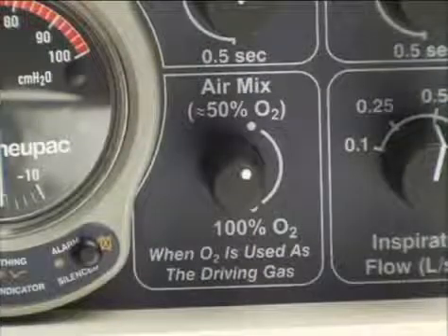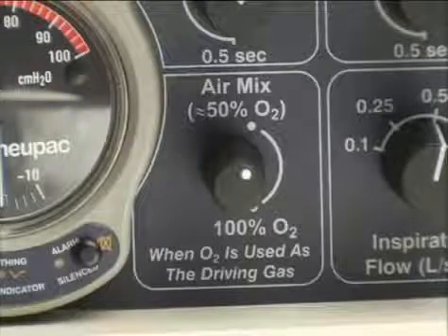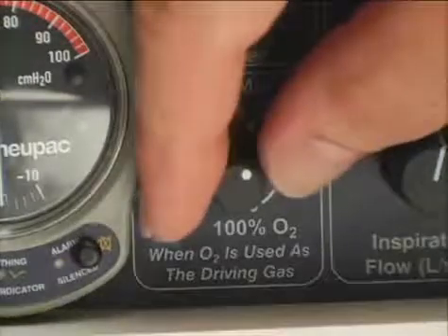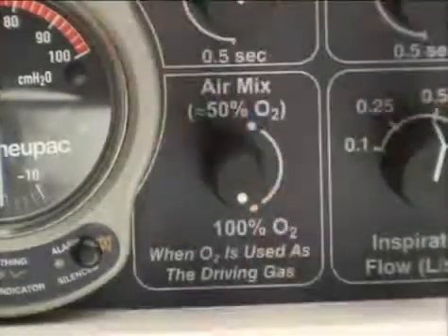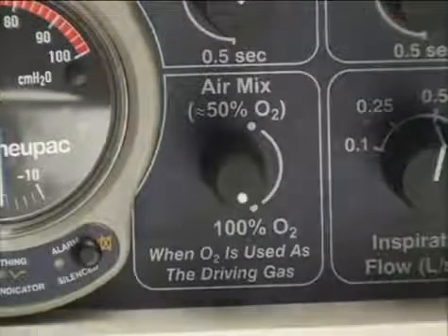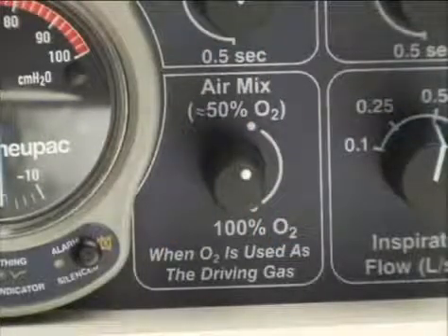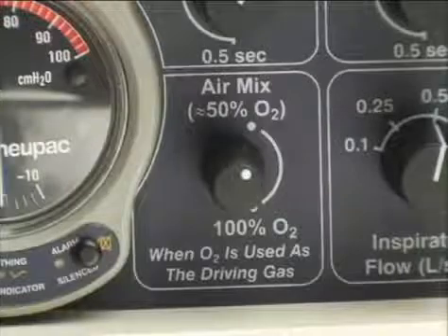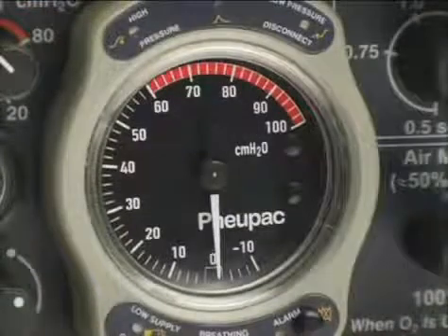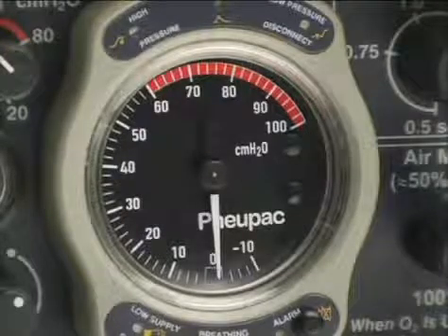Turn this knob to operate a rotary two-position switch that selects 50% or 100% oxygen mode. At 100%, either oxygen or compressed air supplied to the ventilator passes undiluted to the patient. In the 50% mode, a high-efficiency entrainment device mixes ambient air with the supply gas in a ratio of approximately 2 to 1. Use this pressure manometer to read patient inflation pressure, which is measured at the ventilator outlet.